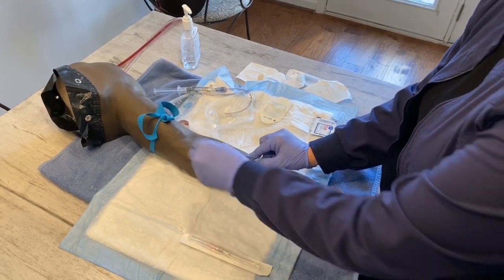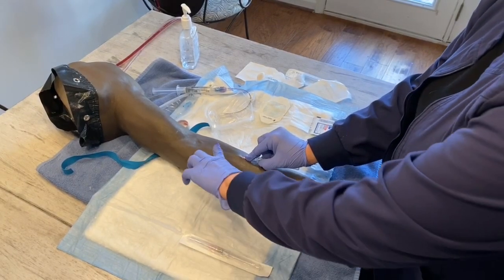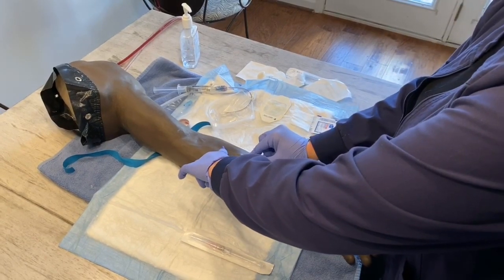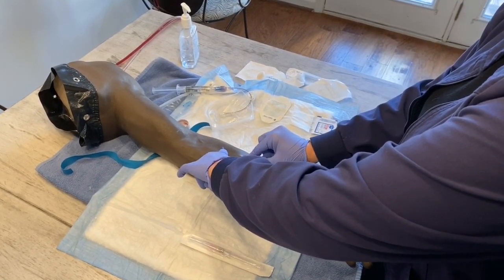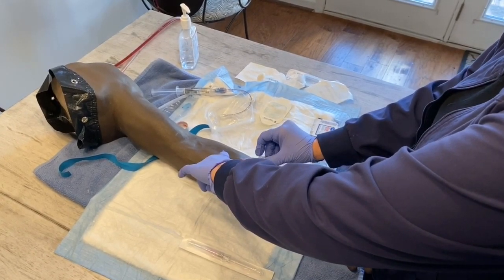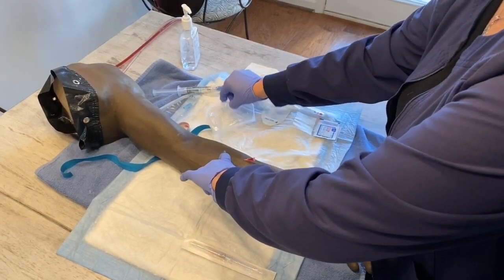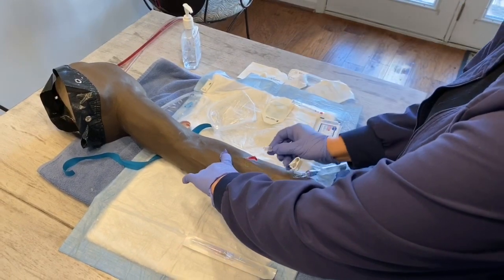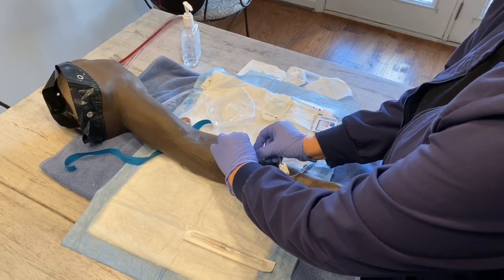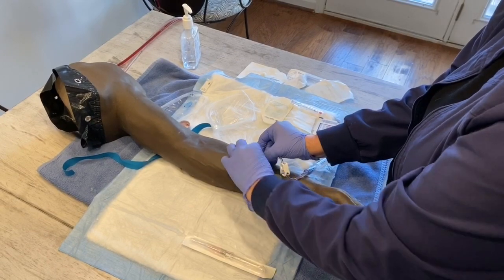Once there, I'm going to take my non-dominant hand and release my tourniquet, and then I want to take my non-dominant finger and actually press above the insertion site so that I can prevent some of the retrograde bleeding that might take place when I go ahead and hit my safety to bring the stylet back and out. It is out, and then I want to immediately get my extension set and go into the catheter. I'm going to stabilize the hub and actually twist and connect my extension set to the catheter itself.